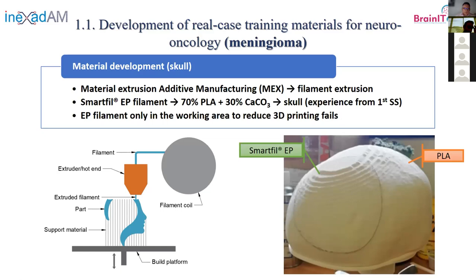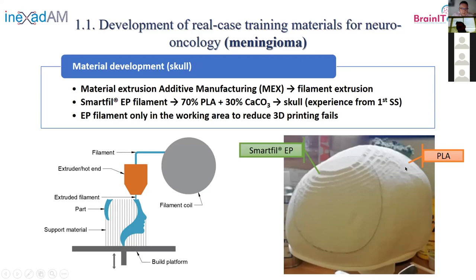This filament has some problems when printing because the calcium carbonate content tends to accumulate powder in the extrusion system. To avoid that, we divided the skull into two parts: we used the Smart Fill EP filament only in the region of interest — the working area — and standard PLA for the rest. This way we avoid printing problems, which is important given that printing these skulls can take around 20 hours.